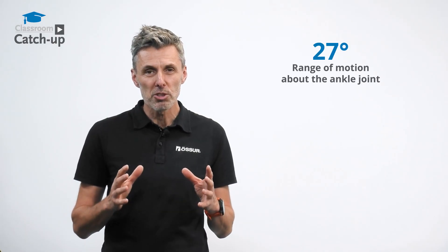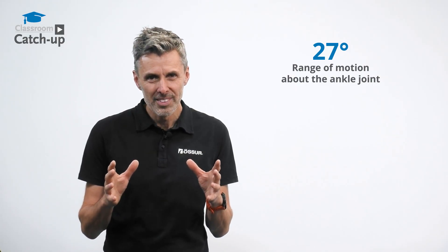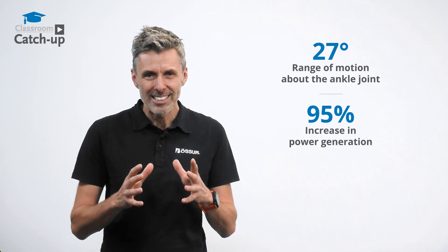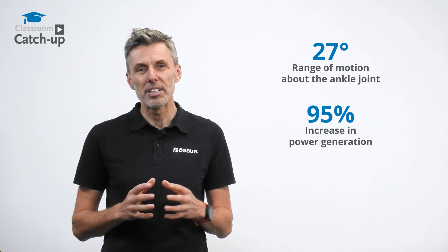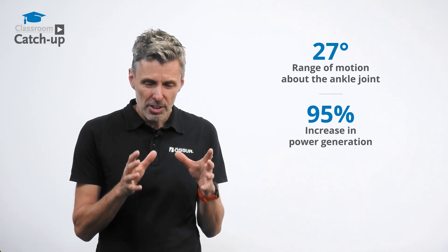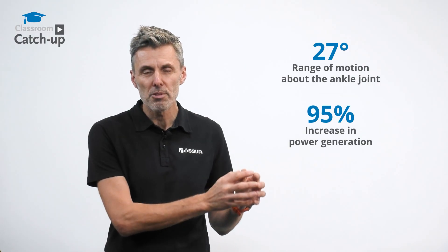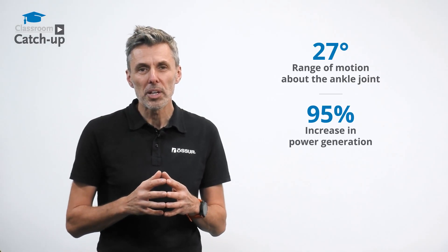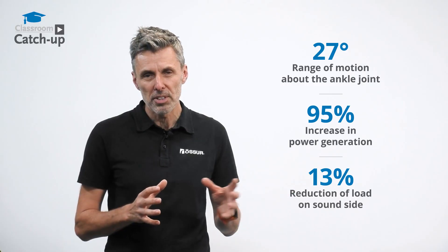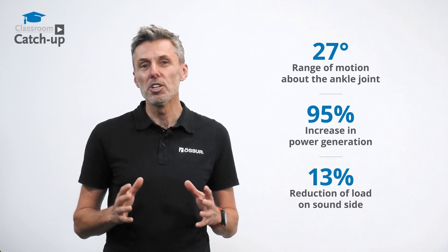Studies have shown that the ProFlex Pivot has up to 27 degrees of range of motion about the ankle joint. In addition to this huge range of motion, we also see levels of 95% increase in power generation about the ankle compared to standard energy storing feet. By carefully managing the stance phase behavior of the prosthetic side, we can also influence the loading response of the sound side — the same studies suggest up to a 13% reduction of impact force on the sound side, which is very important for users in certain health categories.